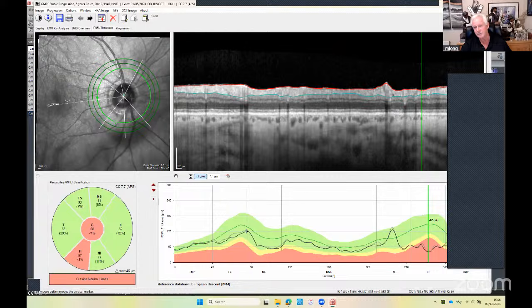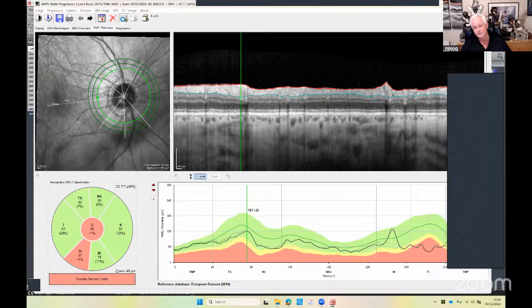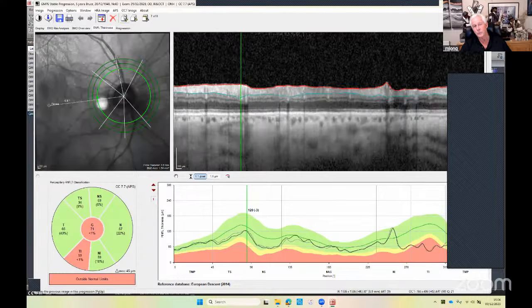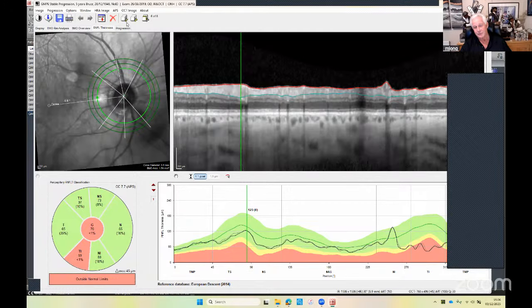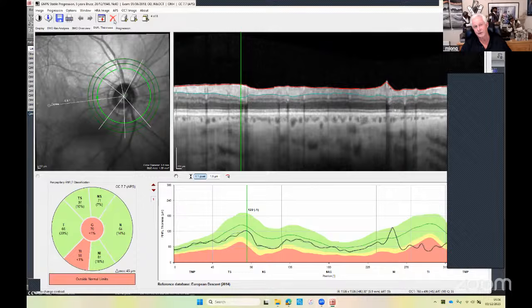But a better test would be to come over here and have a look on this temporal superior hump where there's still tissue to lose. We won't lose any more here. So at the end of the sequence, after 8, we have 121. And if we go backwards in time, let's hope it works this time. We got 120. 123. 122. 122.